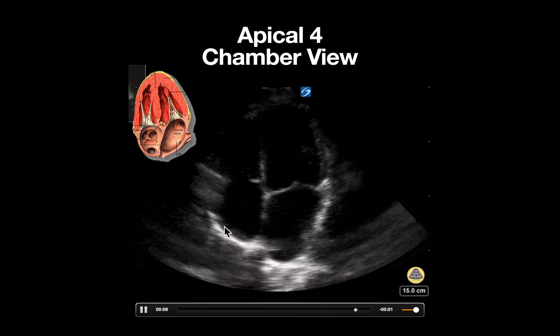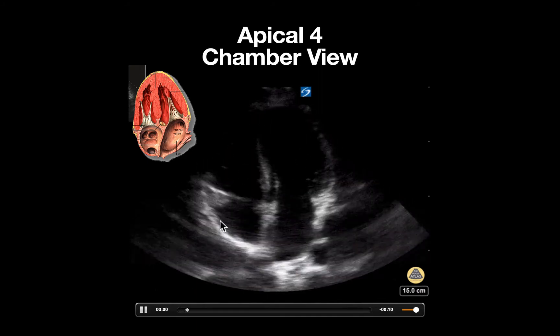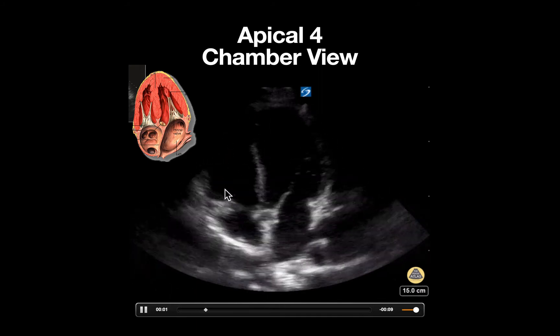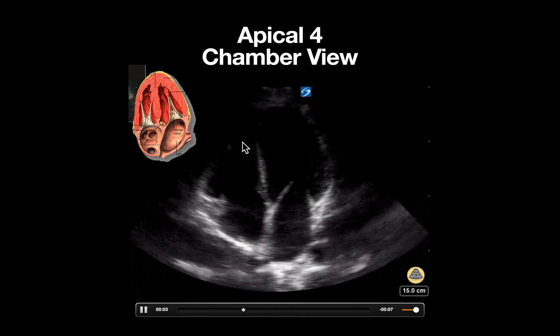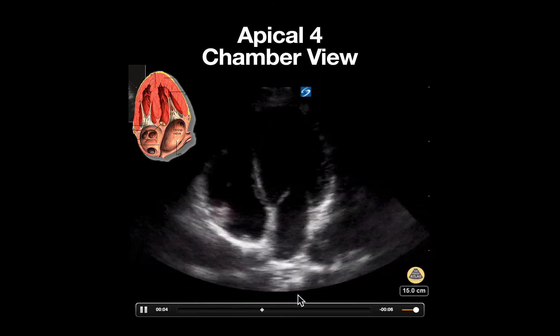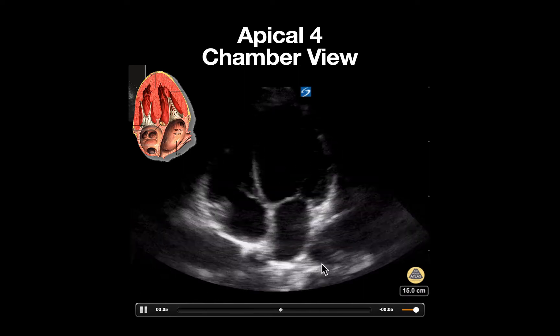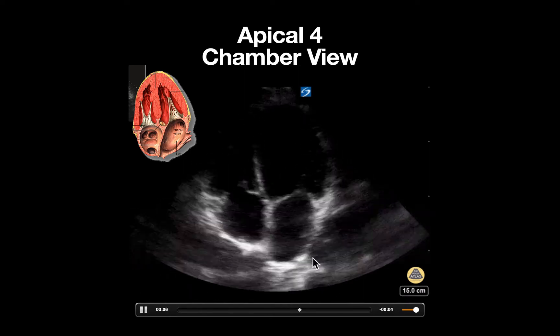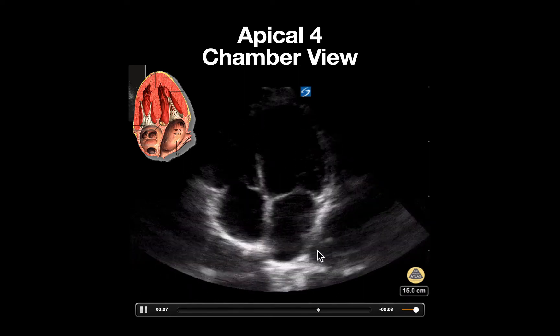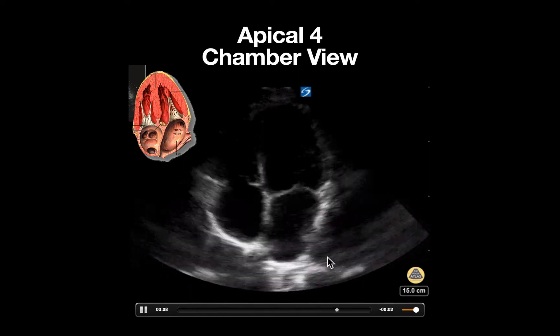We can see the right atrium here, tricuspid valve, and right ventricle. Also notice our circular structure here, which is our descending aorta.